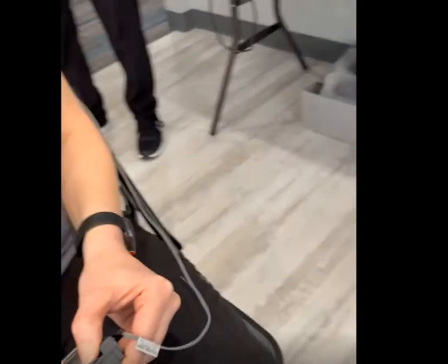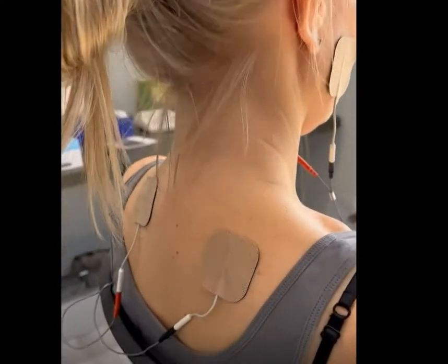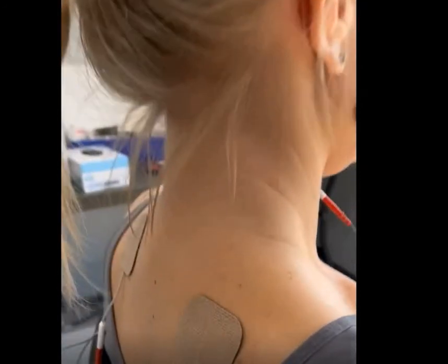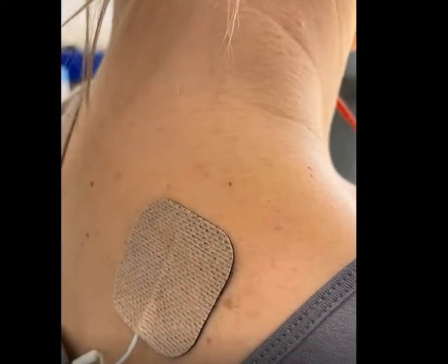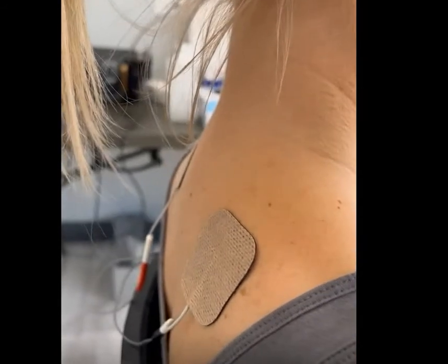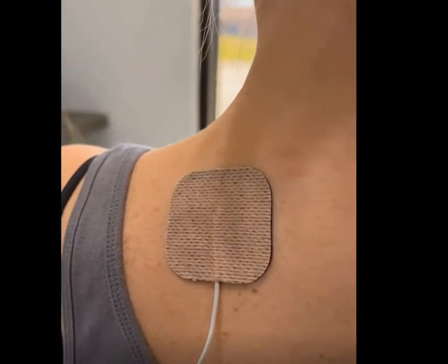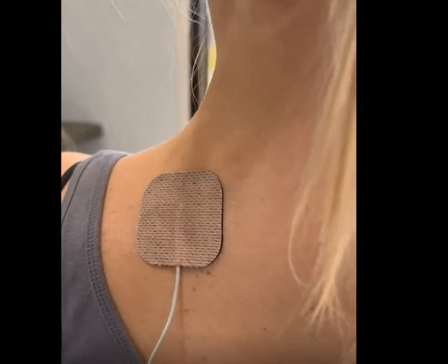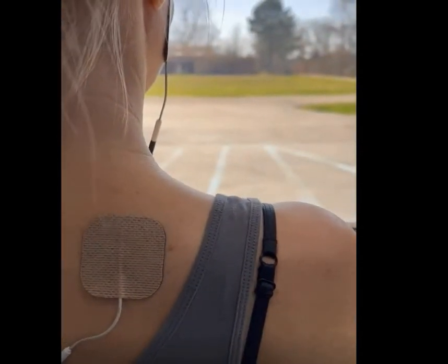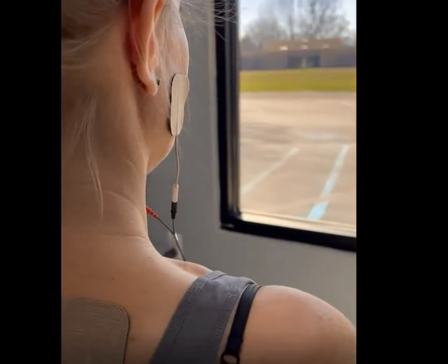Finally, you will start the unit by stimulating the trapezius muscles. This is done by slowly turning up the voltage or the volume button. At first you may feel slight stimulation. Remember that the unit has a four-second rest period, so you cannot rush into turning the voltage up too fast. It normally takes two to three minutes to get the proper stimulation strength. What you are looking for is muscle movement or contraction during the four-second stimulation time and relaxation after that. As you can see here, the shoulders are contracting upward and then relaxing — the shoulders are actually lifting during stimulation. If these muscles are not getting stimulated and you are not seeing movement, then you have to keep increasing the voltage, but do not rush to do so.